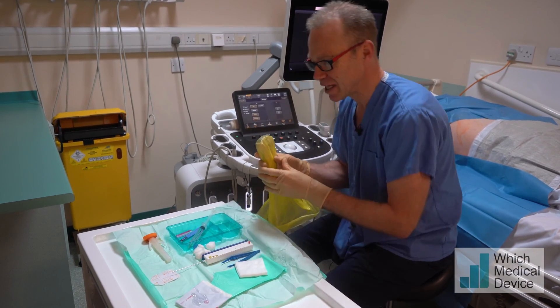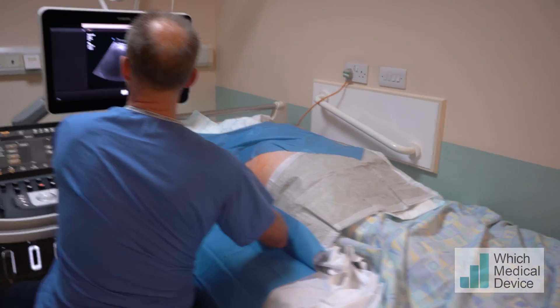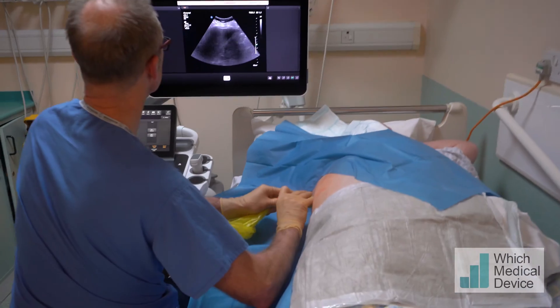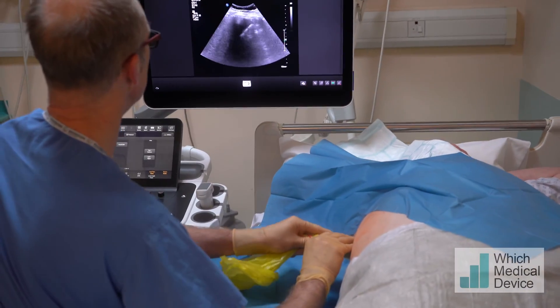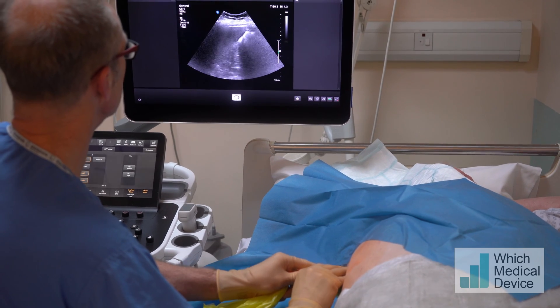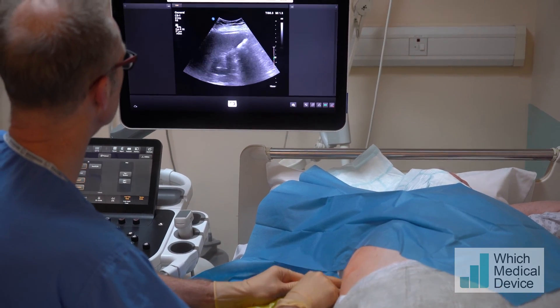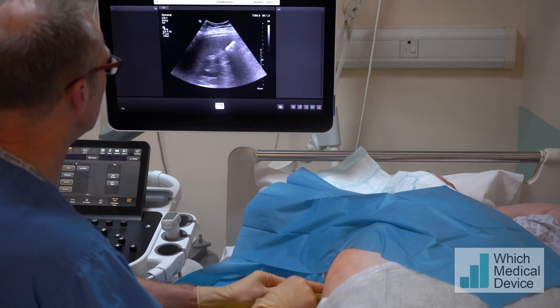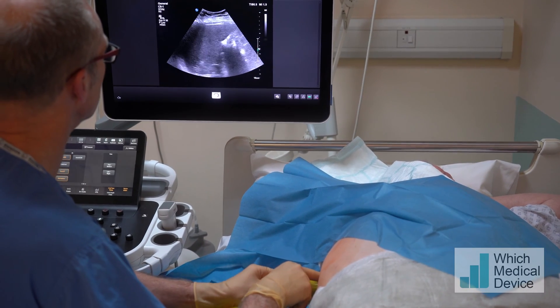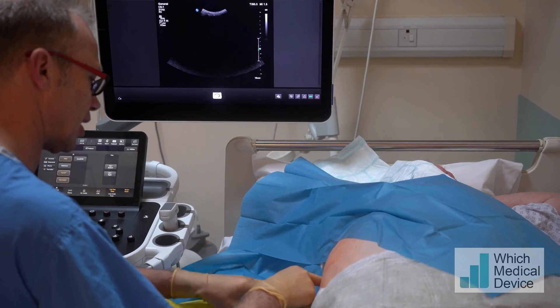We're going to select our position on ultrasound for the biopsy. I'm just going to scan here — it will be a little bit cold and you'll just feel me moving the probe around. We're getting a position here just intercostally, and I'm just going to press with my finger to check the position. That's about right, so we're going to biopsy from that position.